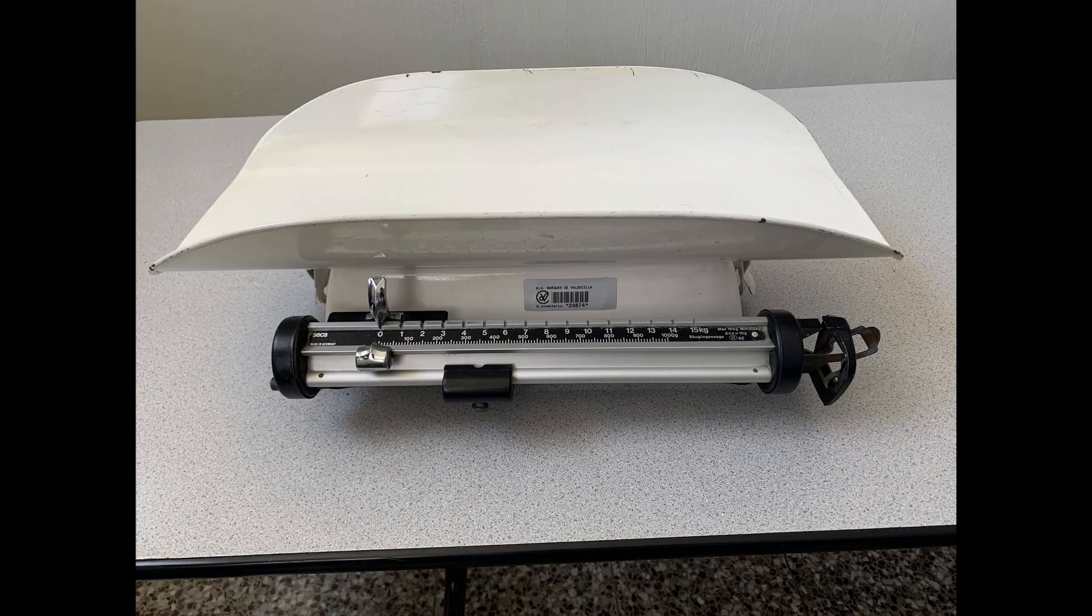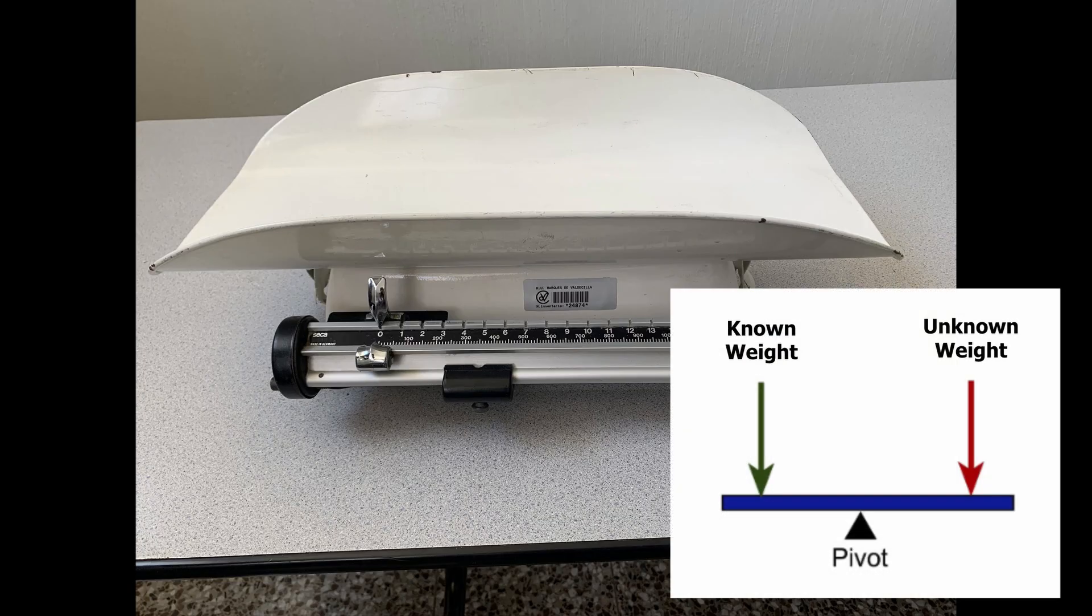All mechanical infant scales, scales that do not use electricity, work by comparing an unknown weight, such as an infant, to a known weight using a lever on top of a pivot. The weight of the unknown object is determined by the operator adjusting the location of sliding weights of a known weight in order to perfectly balance the lever. When the lever is balanced, the position of the sliding weight will indicate the baby's weight.